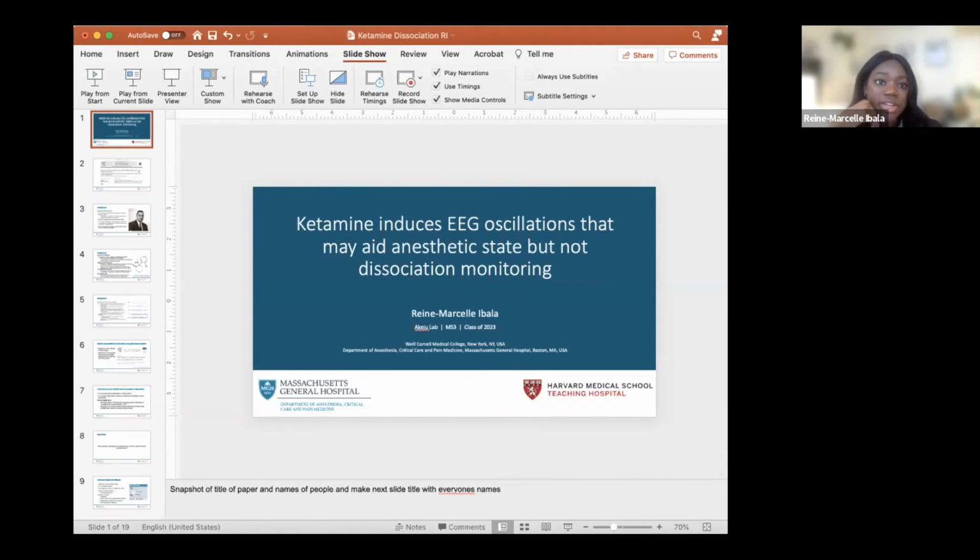From our standpoint, we wanted to look at more discrete dynamics that were more organized, particularly because from our previous studies looking at sevoflurane and then also propofol, that tends to be the way that we've conducted our studies, is being able to identify discrete dynamics, so that when you are an anesthesiologist in the OR, you can pick up this particular wavelength, this particular dynamic, and be able to know that this might be the state that you're dealing with. Looking at an entropy measure, looking at this complexity, is something that we have discussed, but we didn't look at for this particular paper. For this particular paper, we focused more on the discrete dynamics. Okay, thank you.